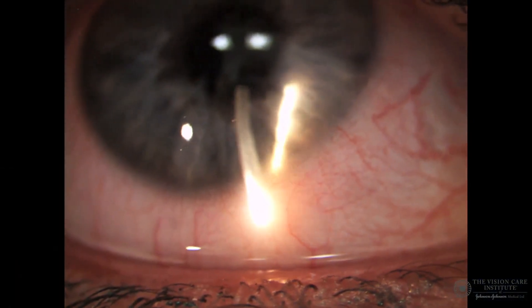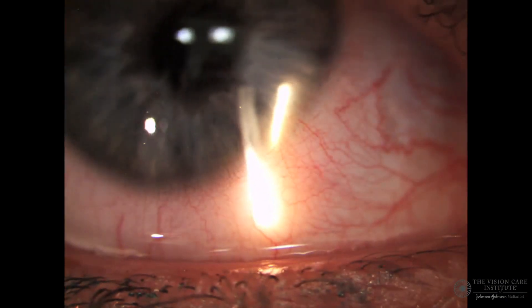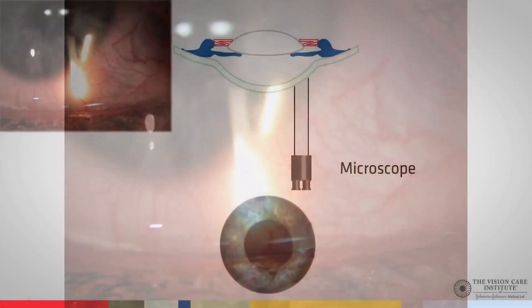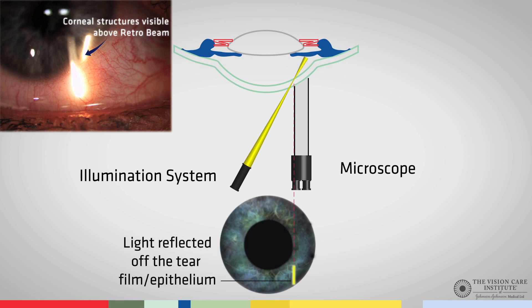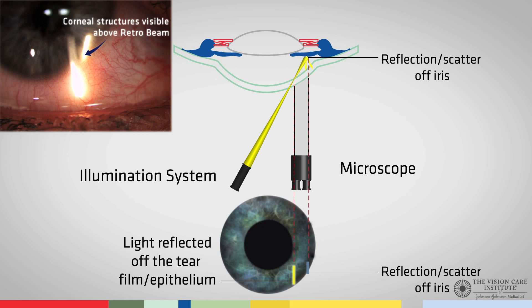We can now start seeing some corneal structures. As this diagram shows, in essence what we are doing is shining the illumination system through the cornea. The majority of the light passes through, but some of it forms the reflected corneal section that we can see here. The majority of the light that passes through strikes the iris and scatters off the iris before illuminating the cornea from behind, forming the blue patch as we see here. If there are any blood vessels or other structures in the cornea at that stage, they will be illuminated from behind and will be visible in the light that we see as a retro beam.